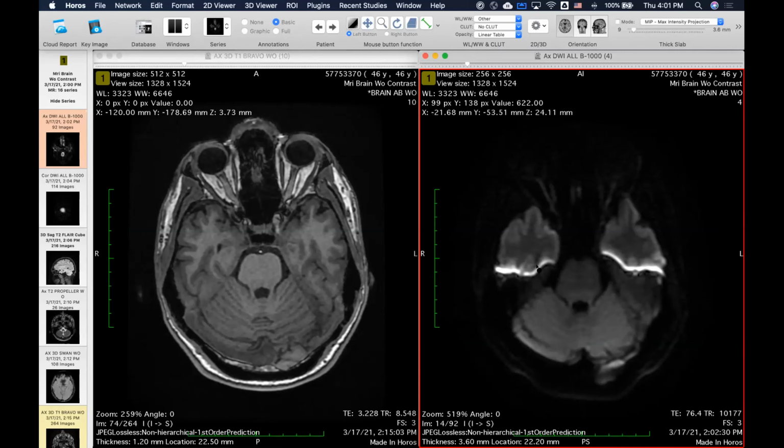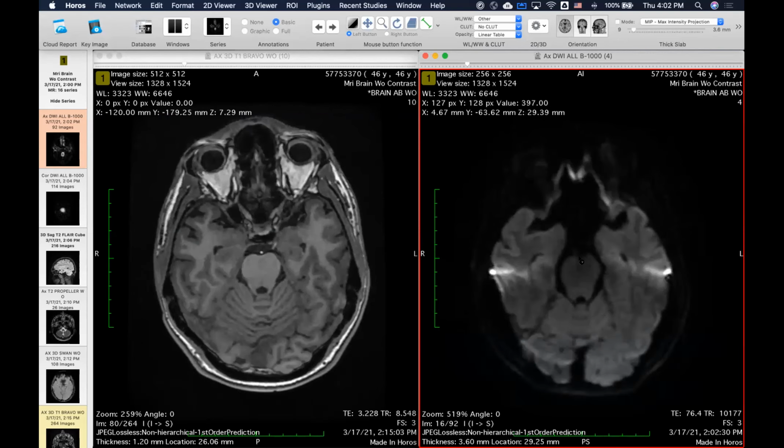Okay, so this is called pile up artifact, and that will be true only when it's a spin echo. With spin echo, you don't get the T2 star loss that is typical, but you do get geometric distortion. And so things pile up. If this was a regular echo planar without the spin echo, then this would just be a hole, like a black hole, no signal whatsoever because of so much decay. All right, so that's a fun one.